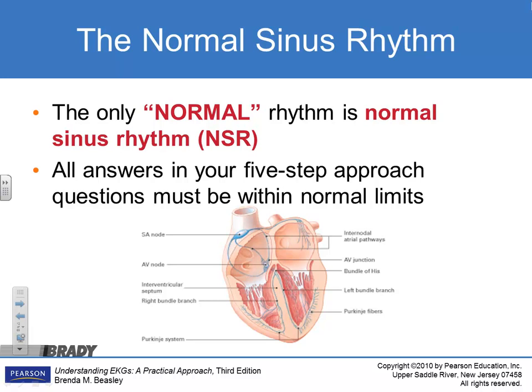And that's going to train your eyes to be looking for the specifics that go with that rhythm. Now, when I look at a rhythm, I don't do that anymore unless I can't figure it out. Then I'm going to go back and go through each one of those steps. But if you'll start out going through those steps, and that's what you will be doing in your workbook.